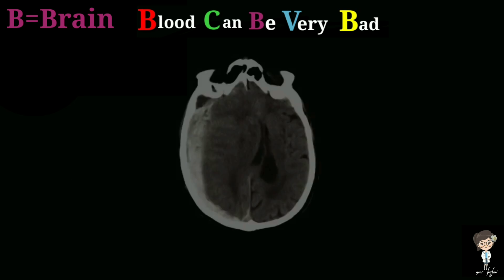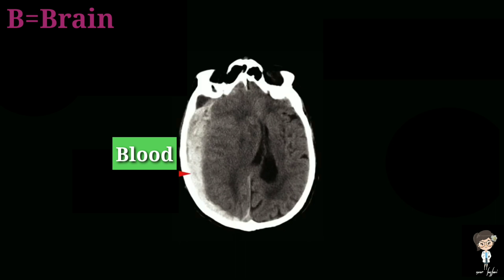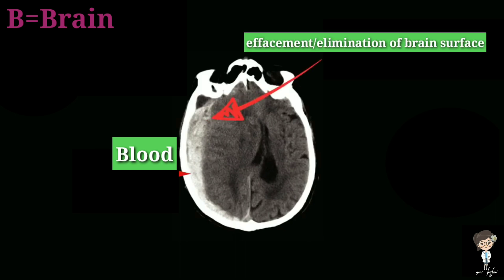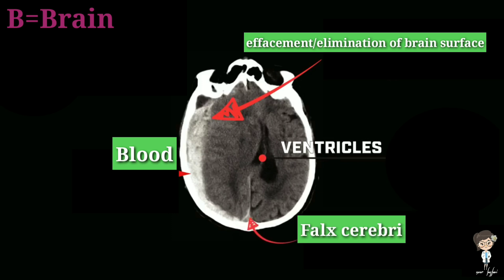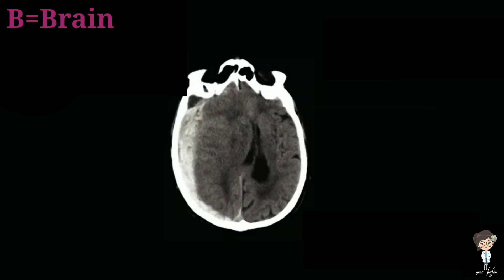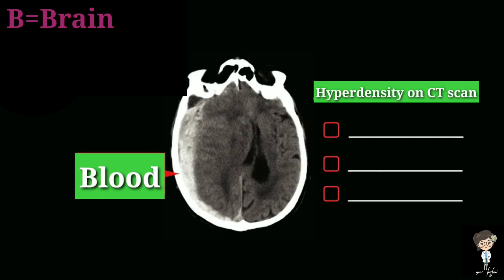The next B of the mnemonic stands for Brain. We will look for the presence of blood, which will cause effacement of the brain surface. After this, we will see the symmetry of cisterns and ventricles. We will also observe the falx, which should be in the midline. On CT scan of brain, blood pooling appears as hyperdensity. Other things that can appear as hyperdensity on CT scan brain are bone, calcification, and IV contrast.